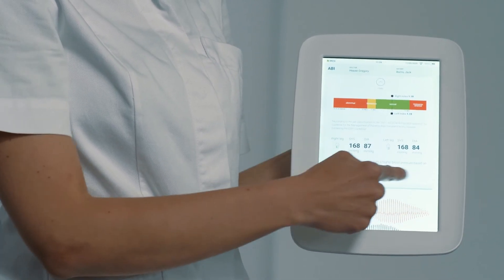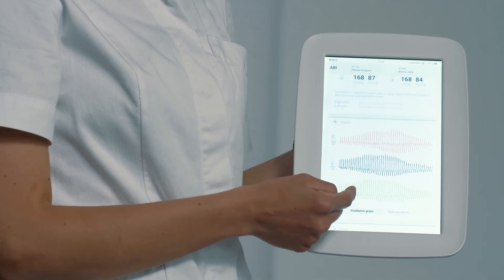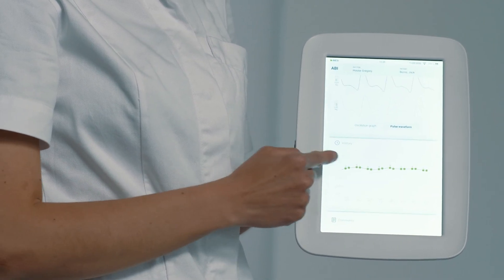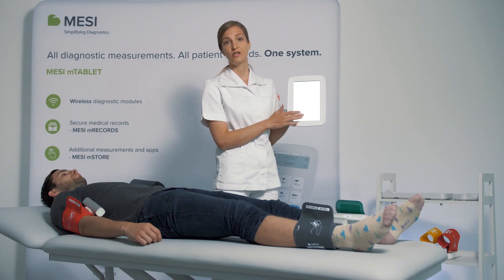You also receive individual pressures in all the extremities, and you receive the oscillation graphs and pulse waveforms for the entire measurement. You can monitor the patient's trends through the history tab and you can add any comments that you have.